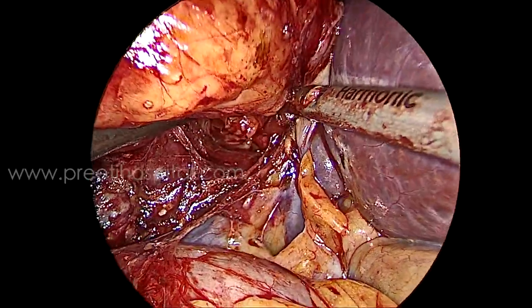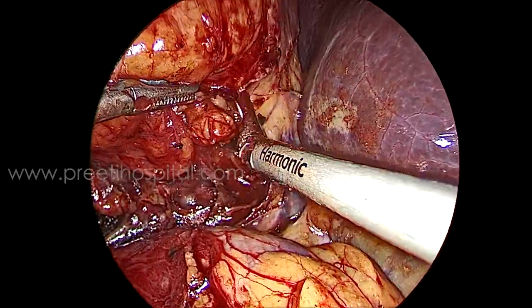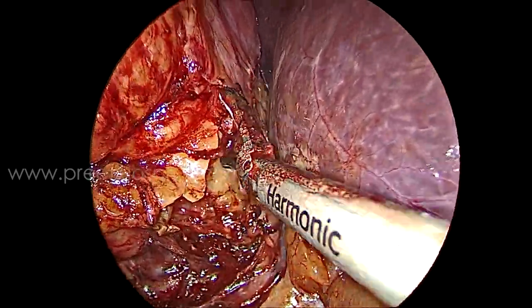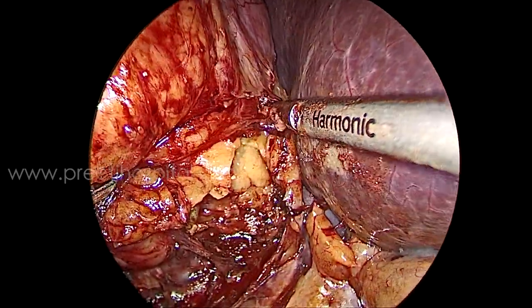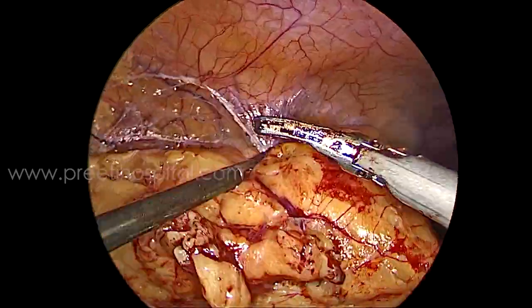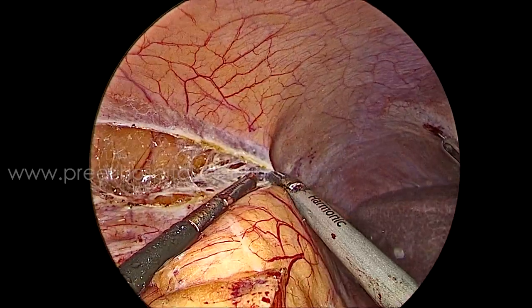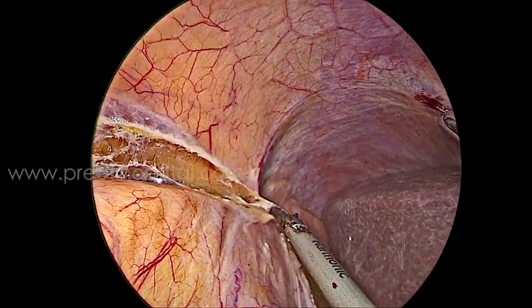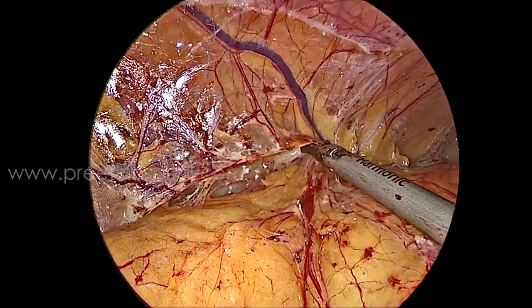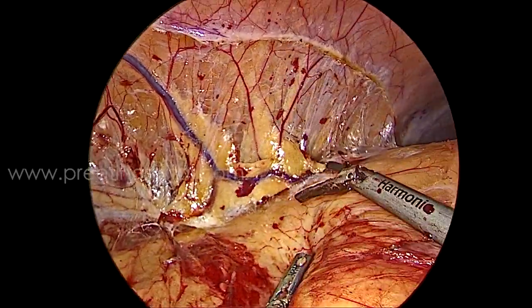It is all well now — ready for mass clamping or separate clamping. Normally in laparoscopy we mobilize the kidney a little bit for lateral tumors because your view will be good and suturing will be better. We mobilize and release up to the diaphragmatic region below the liver.